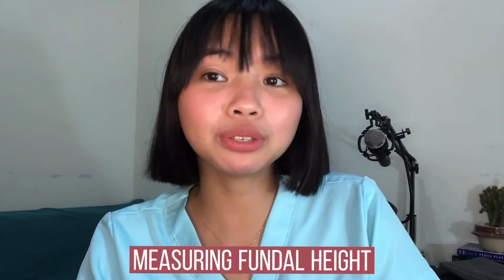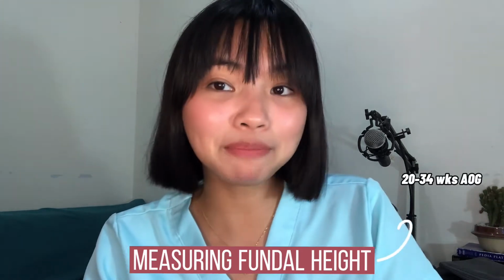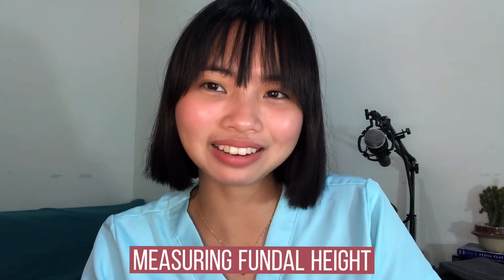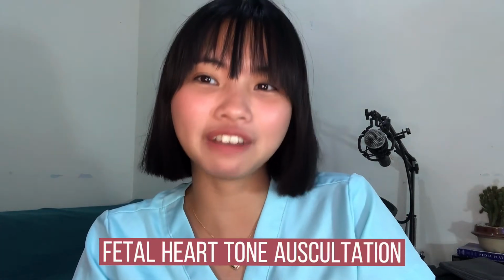So today, I'm going to teach you how to properly measure fundal height and how to detect fetal heart tones. But first, you must remember to properly wash your hands and sanitize. Fundal height is used between 20 to 34 weeks of gestation. For this procedure, you need a tape measure in measuring the fundal height. Detection of your fetal heart tones is a positive sign of viable pregnancy.